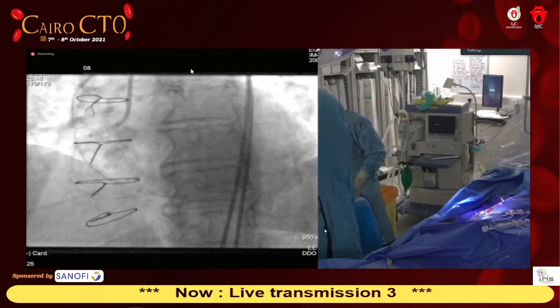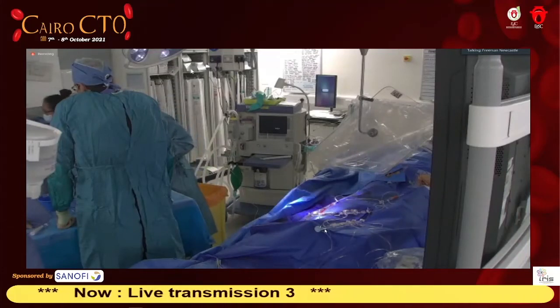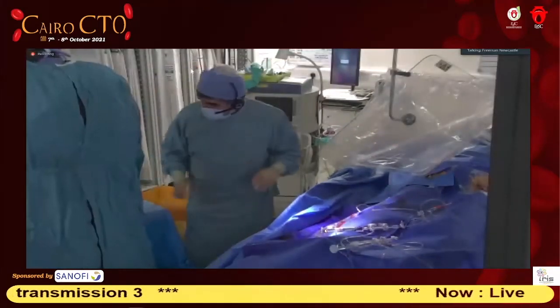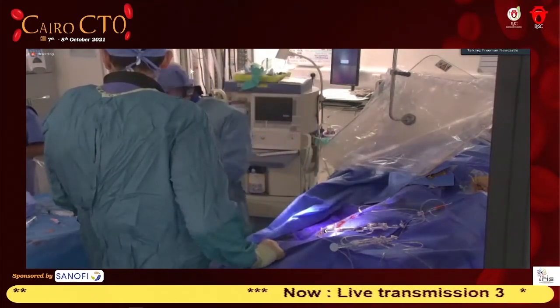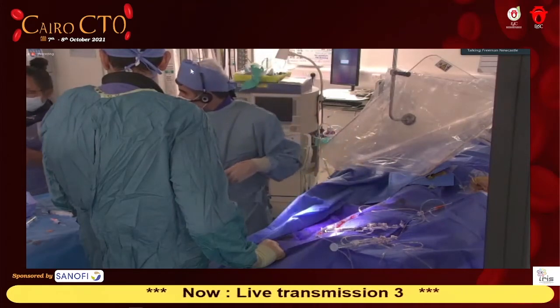I'll take this one. Yeah. What's the other one? Show me the 4x3. The 4x. Turn it around. Turn it around. Yeah, I'll take this one first, and then I'll take the other one. So of course the coils are nitinol, right? And they come as a line. I'll show that to you. Yeah, 4x4.